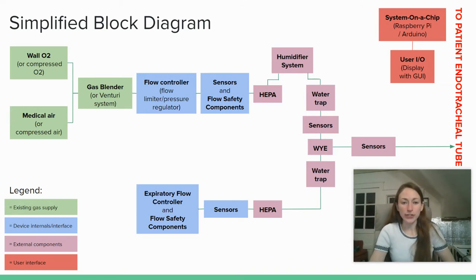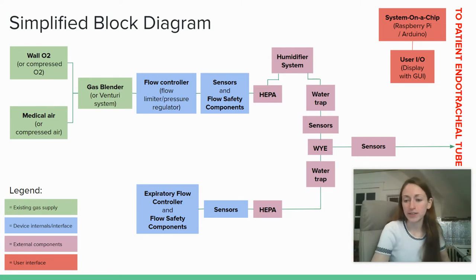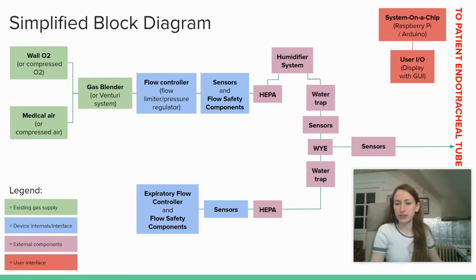Downstream from there, we have our first flow controller block. That's one of the portions of the device we'll be considering today, followed by a number of sensors, maybe your O2 and pressure sensors, and some flow safety components, potentially a pressure release valve or an emergency breathing valve, devices like that. Then we move into the device externals. Here you'll find the humidification system. This may be either a heated humidifier or an HME, a heat and moisture exchanger, as well as the rest of the respiratory circuit that leads to the endotracheal tube of the patient.